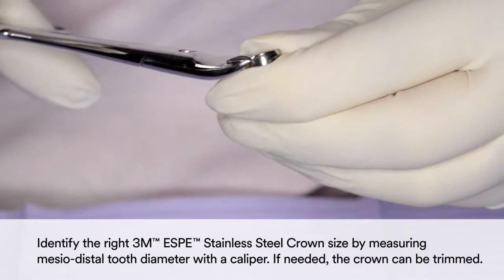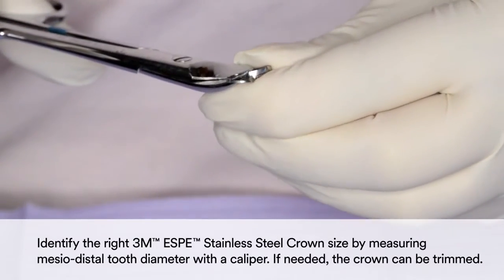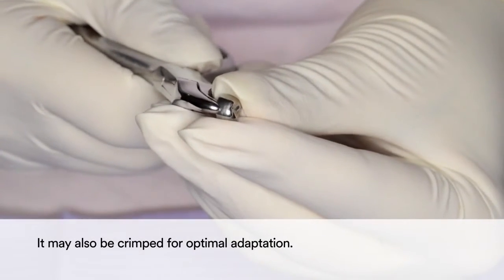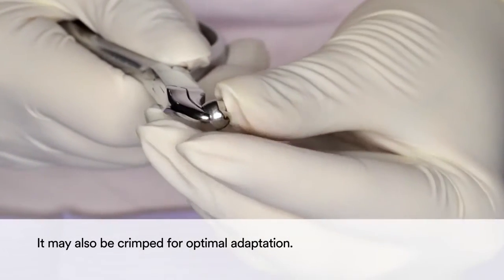Identify the right 3M Stainless Steel Crown size by measuring the mesial-distal tooth diameter with a caliper. If needed, the crown can be trimmed. It may also be crimped for optimal adaptation.